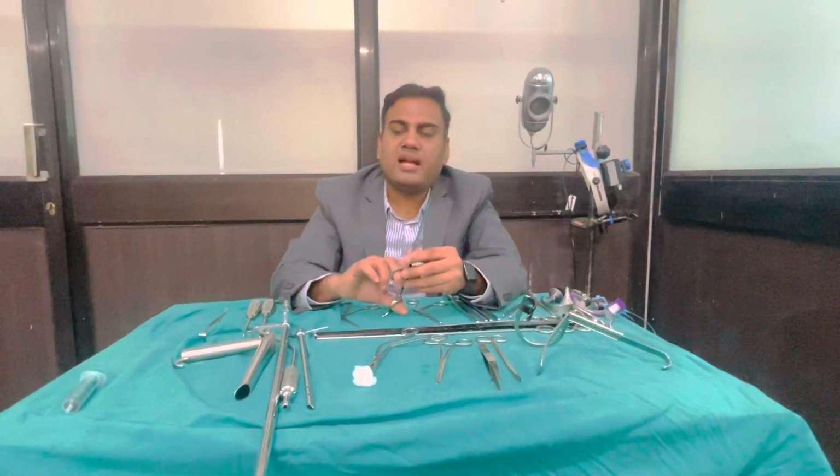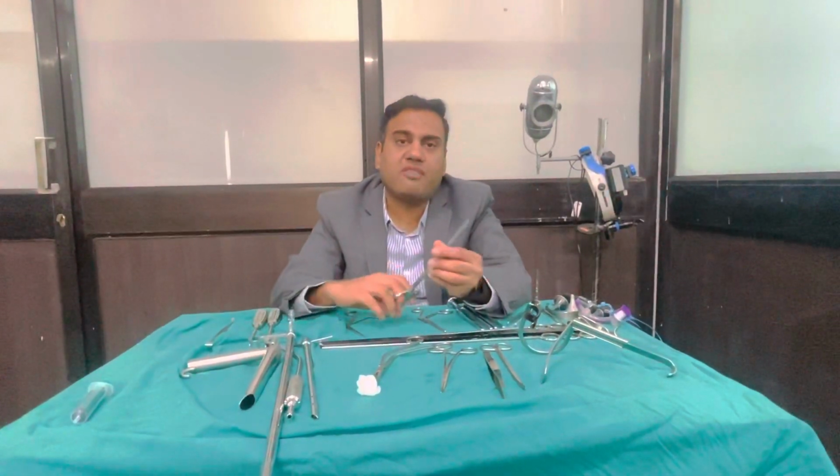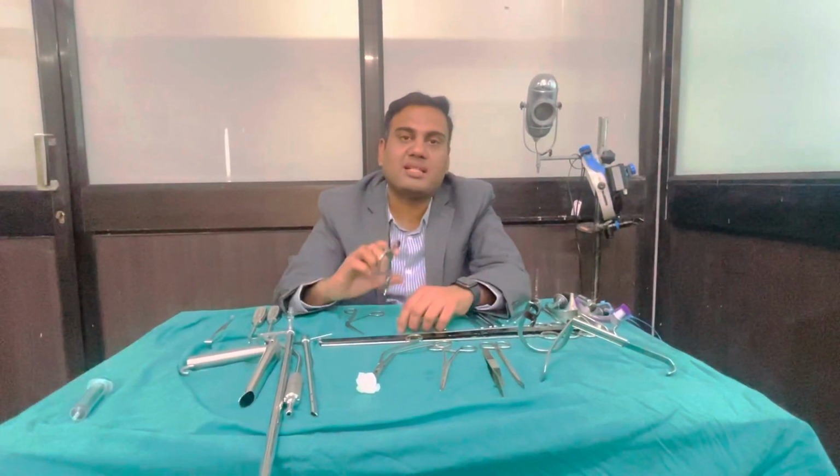This is one of the methods called the dissection and snare method. There are other methods of doing tonsillectomy, hot and cold methods like using a coagulator or harmonic scalpel or even lasers, cryosurgery. These are different methods of doing tonsillectomy. But it is very important that you understand this is the conventional and still very commonly practiced method, the dissection and snare technique.